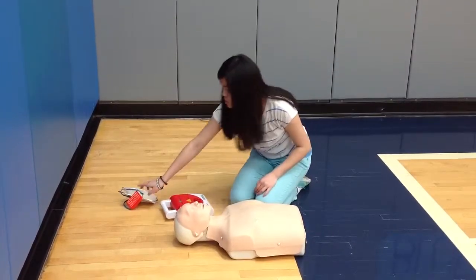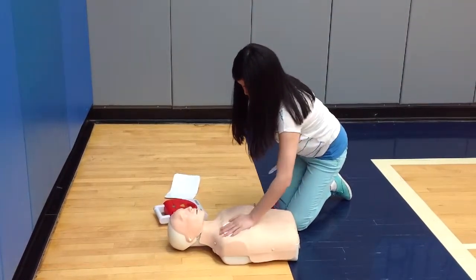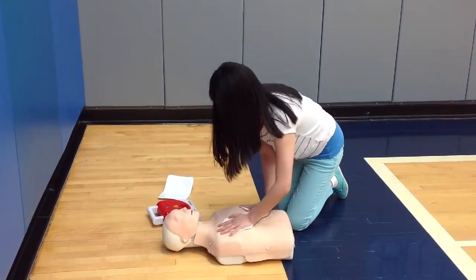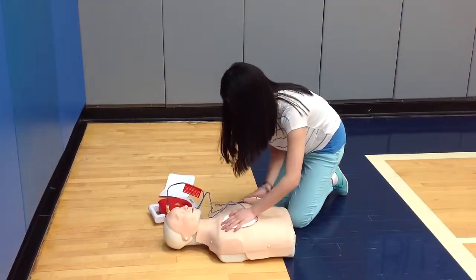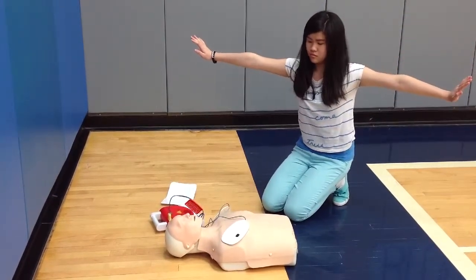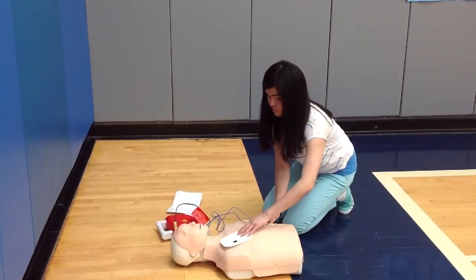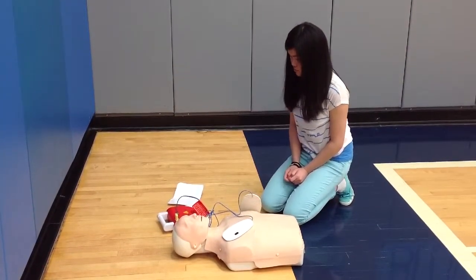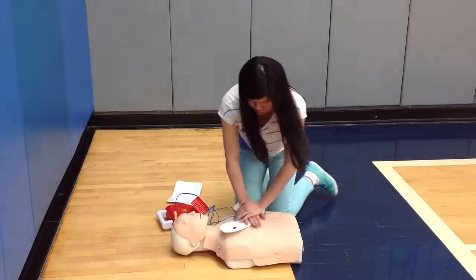Attach pads firmly to person's chest and shoulder. Plug in connector. Check connector and pads. Analyzing reading. Everyone stand clear. Stay clear, everyone. Shock advised. Charging. Everyone stand clear. Push the shock button. Shock delivered. Begin 5 cycles of CPR.